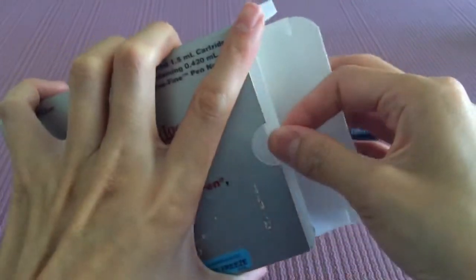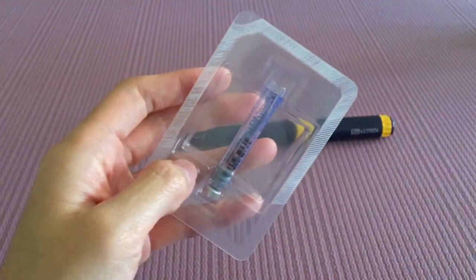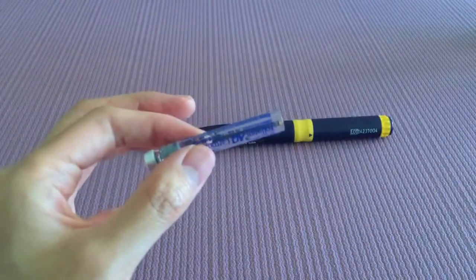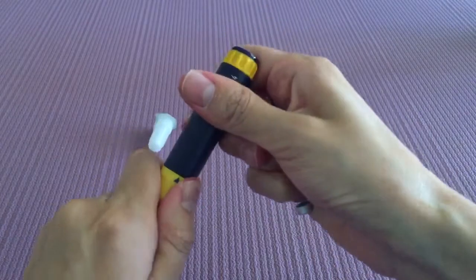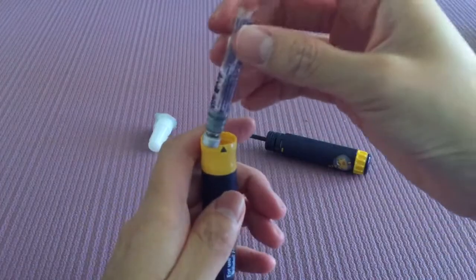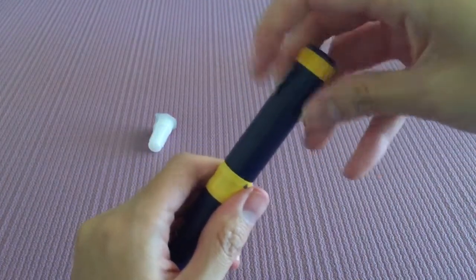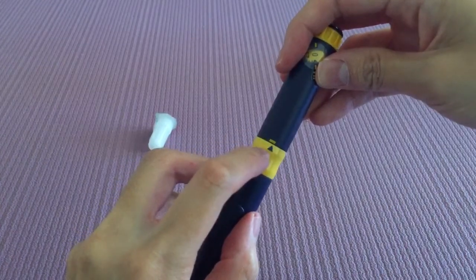Let's take a look at the cartridge itself. This one is already empty — I just wanted to show you how you can fill up the pen. You're going to take your pen, unscrew the top, then take your cartridge metal tip down and just drop it in. Put the top back, screw it very tight, and make sure that yellow line matches up to the triangle.